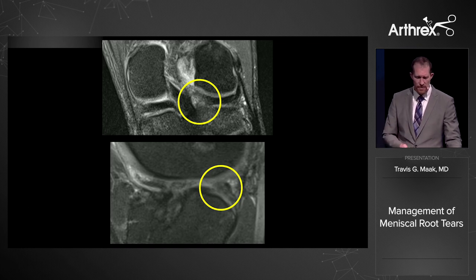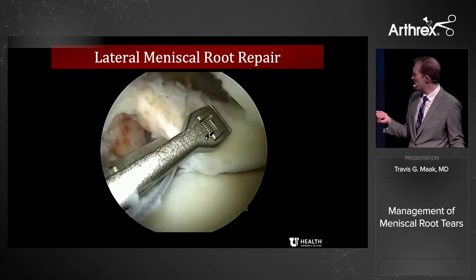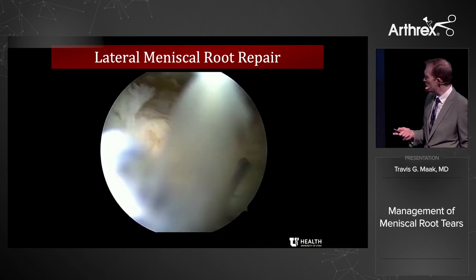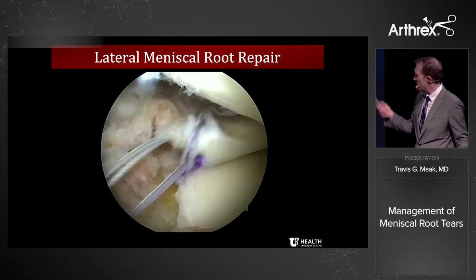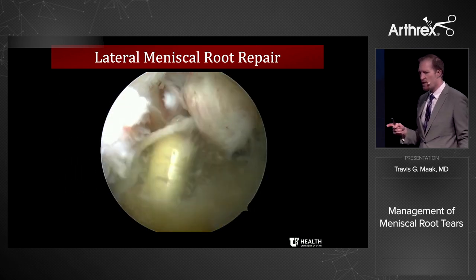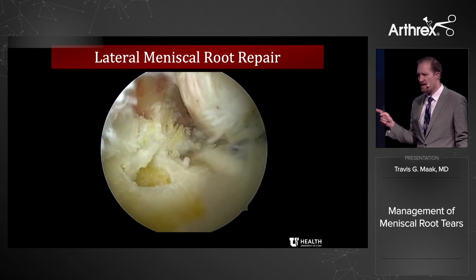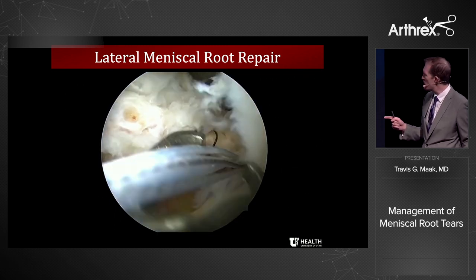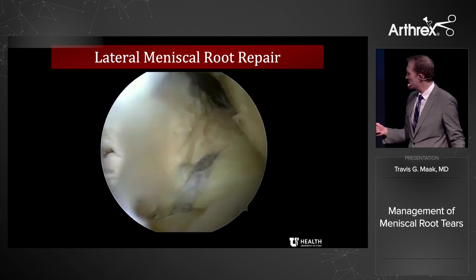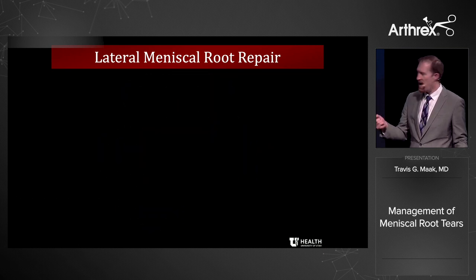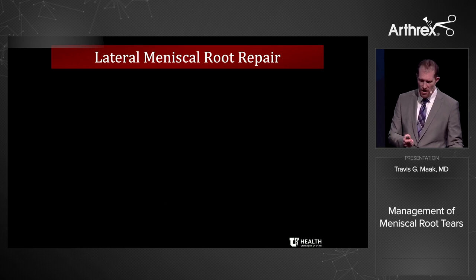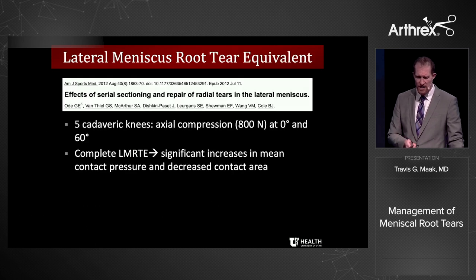It's harder to see the lateral root than the medial root. Using minimally invasive techniques with the meniscal scorpion, two half-hitch sutures in a luggage tag technique are placed in the root. This is a ligament avulsion, so you can see where it's avulsed off the root. Because it's done with an ACL reconstruction, I'm not using the flip cutter here — I don't want the tunnels to converge. Instead I'm using the standard 3.0 drill with a nitinol wire, taking the suture retriever, grabbing them all, dunking it down, and doing a direct trans-osseous repair prior to the ACL reconstruction. In both cases you can do a simple, easy, high-strength construct with or without ACL reconstruction.